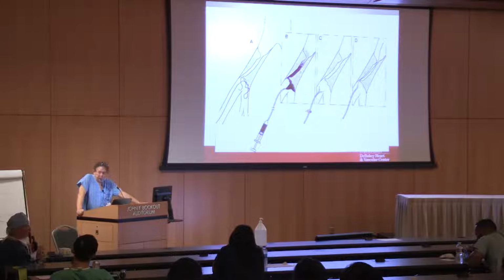And backing up, again, what I try to visualize is this red hot fireball sitting there under the image detector, this image intensifier. I think about it as a red hot ball, and as you back up, it drops off the radiation very dramatically. So again, you back up 6 feet, you're practically getting nothing. If you watch the radiologists, most of the time when they're doing DSA, they're out of the room with somebody remotely pushing a button. There's nothing wrong with that.